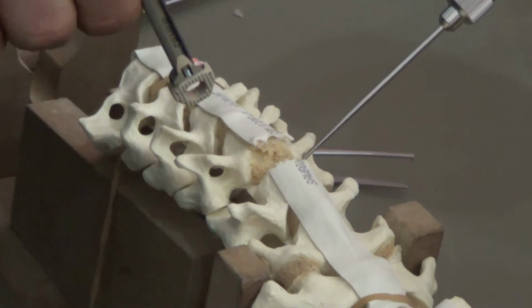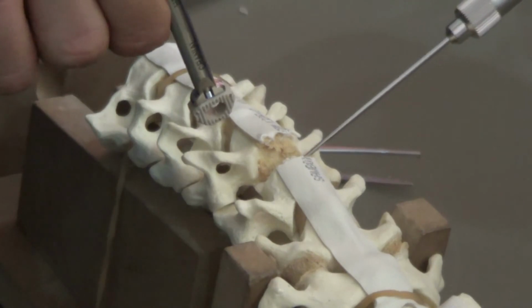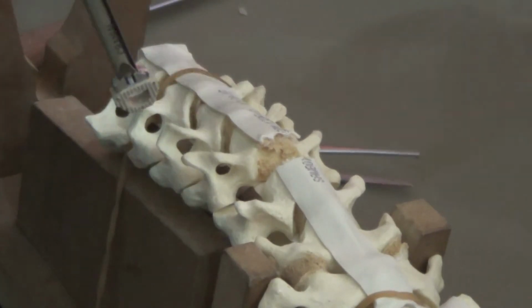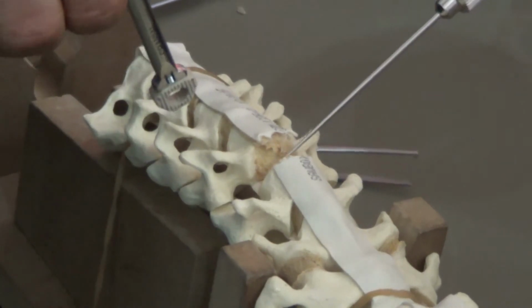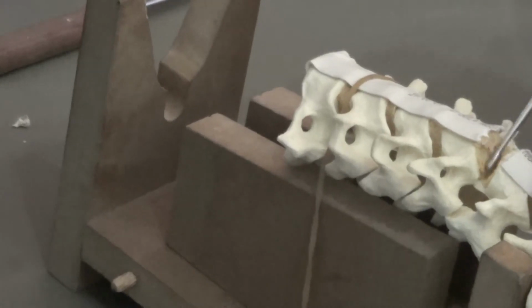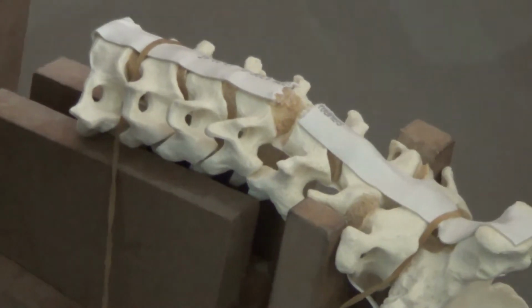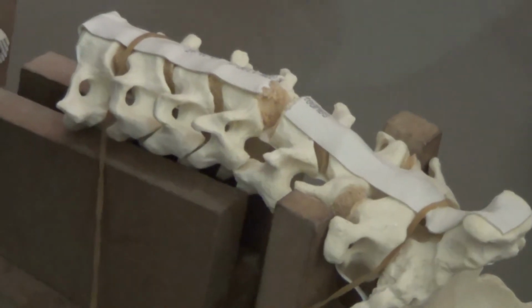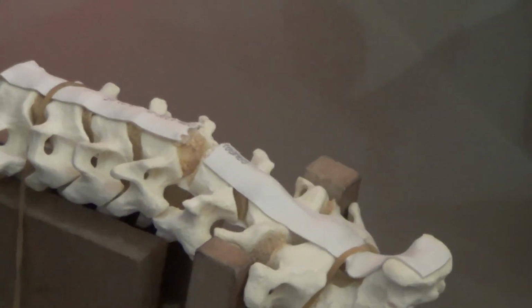When you go to the level of the posterior edge of your articular cartilage, you can easily see and sometimes feel your posterior longitudinal ligament, provided it is not traumatic, then this posterior longitudinal ligament is intact. You can feel it, especially by using a small curette. Then you will have to make your incision over this posterior longitudinal ligament, just one incision, not multiple times, otherwise you will damage it. So you will understand.